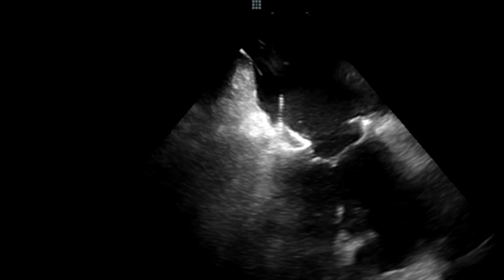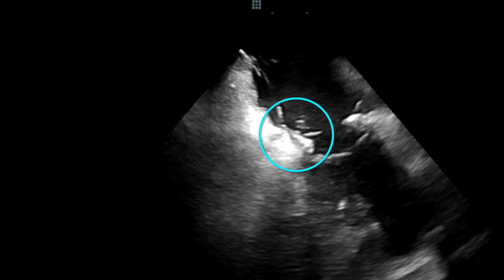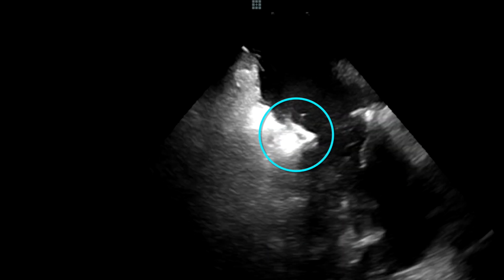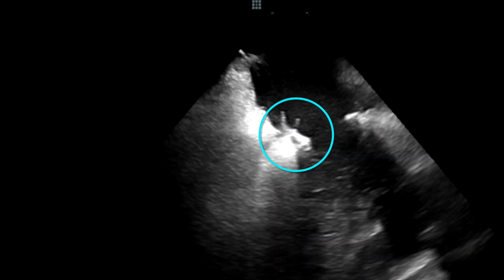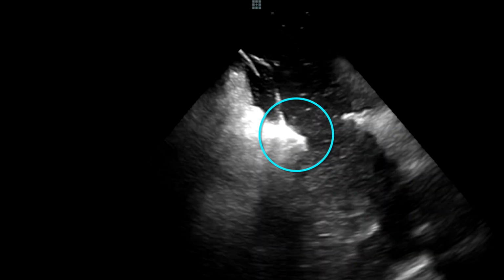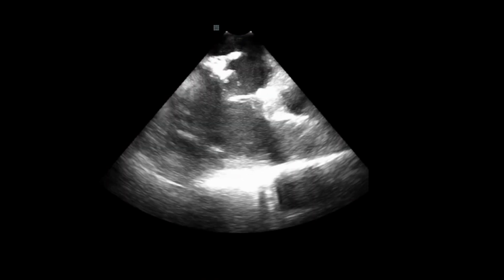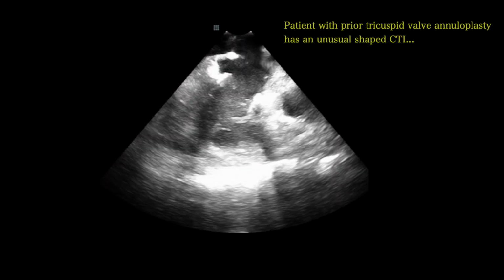Now we had to actually see that area and advance the ablation underneath. You can see that because of that very narrow spot, we did have a steam pop right there. But this lesion was the one that caused bidirectional block across the isthmus. Here, this is another case.